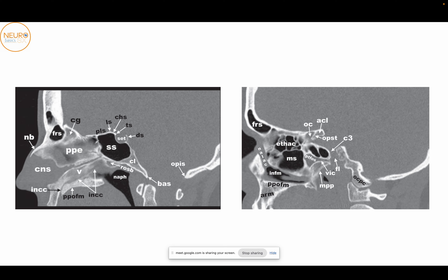Now coming to sagittal imaging — more or less the same structures in bony anatomy, but you can appreciate a few things nicely in sagittal imaging, especially the pituitary structures. Here you've got the sphenoid sinus. A few important things to realize: this is the lower border of the sphenoid sinus — anteriorly it is formed by the rostrum of the sphenoid, and posteriorly by the clivus. The posterior border of the sella is formed by the dorsum sellae, and the anterior border by the tuberculum sellae. The tuberculum sellae leads into the chiasmatic sulcus on which the chiasm lies. Just at the anterior border of the chiasmatic sulcus is the limbus sphenoidale, which turns and becomes flat to form the planum sphenoidale. So you have: planum, then limbus, then chiasmatic sulcus, then tuberculum sellae, then the sella, then the dorsum sellae, which turns into the clivus.